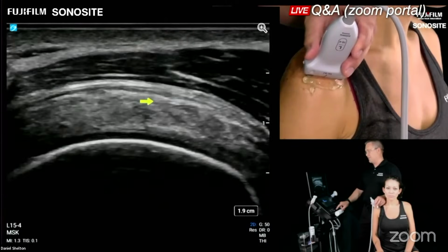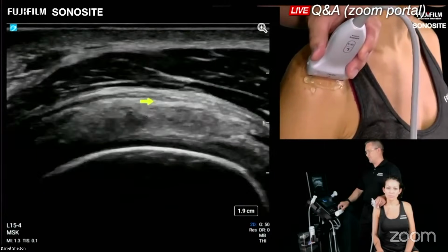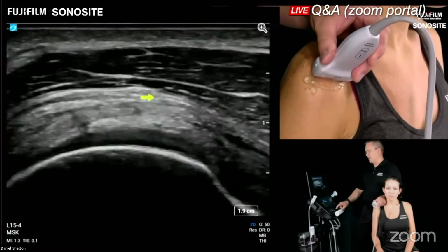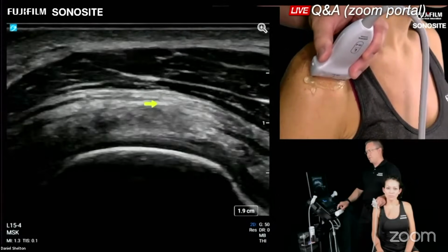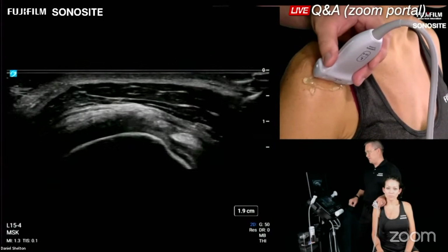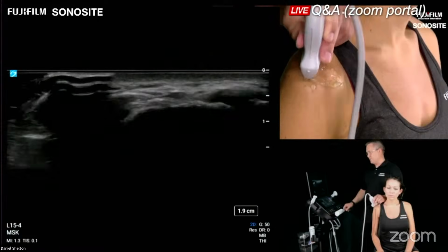And there's a lot of published findings on that thickness, and just use your clinical impression. Does it compress? Is it effused, or is it just synovitis? Put your color power Doppler on and see if it's inflamed, or maybe something else is going on in the bursa. So that's one way to do a subacromial evaluation with internal and external rotation. I'm going to hit 2D to escape my zoom, and now I'm going to go long axis to the supraspinatus, and we'll do the subacromial impingement.